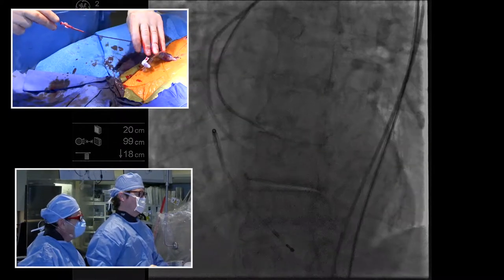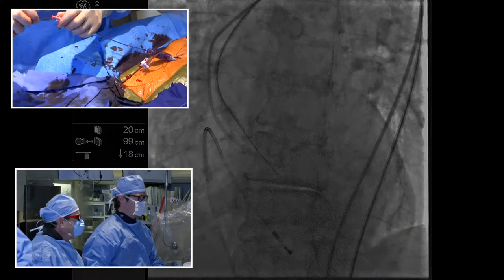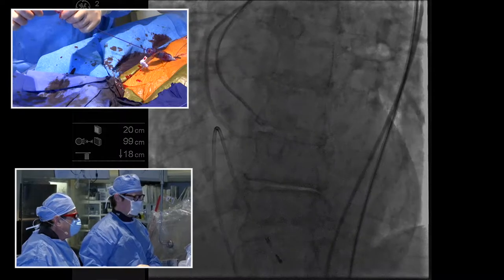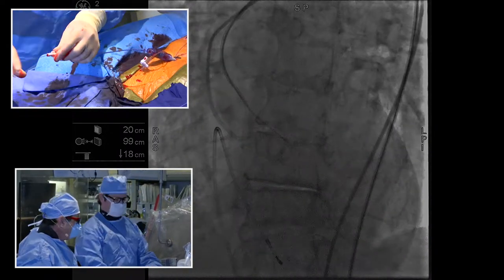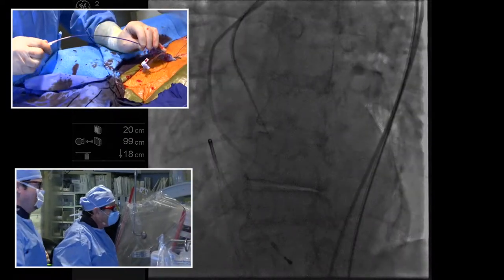And sometimes I'll give it back to him, and when we finally, we've never not crossed. But there's been times that it's taken 10, 20 minutes. And some patients who have prosthetic valve disease, it can be harder to cross. All right, so now he's going to give it to me, not that I'm any better. Wouldn't it be cool if I got right through right now?